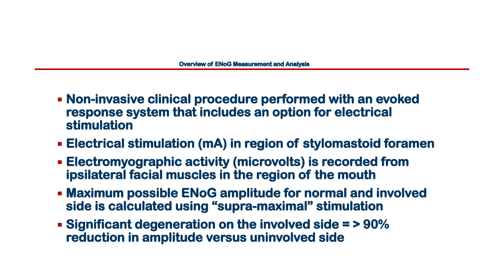But what you're recording is not a nerve response directly, it's an electromyographic response. In other words, it's muscle. And that is recorded in microvolts. So the stimulus intensity is in milliamps. It's a constant electrical current, but the response you're recording is a muscle response, and it's in microvolts. Of course, since it's muscle, it's much bigger than the ABR or any electrical response you record from the brain. So it could be 1,000 microvolts, which, a microvolt's small still, but 1,000 microvolts is like 2,000 times larger than the ABR. So it's a muscle response, so it's going to be big.